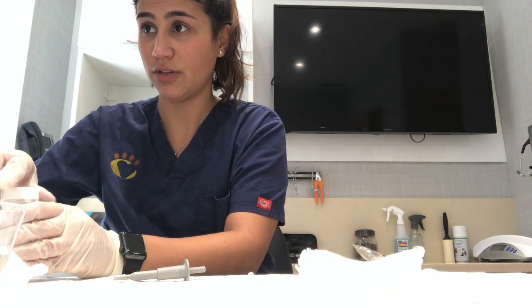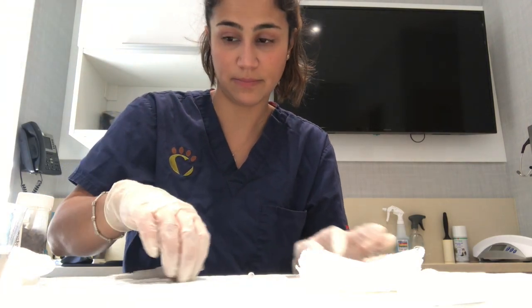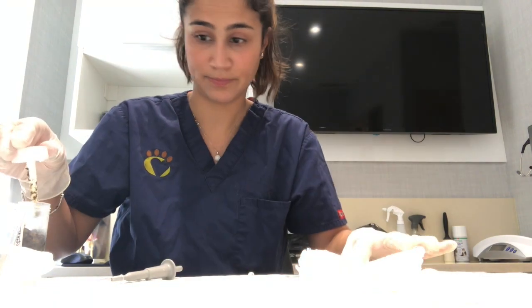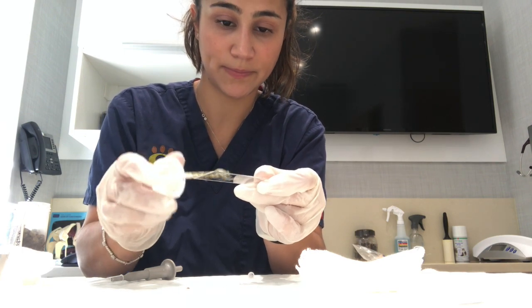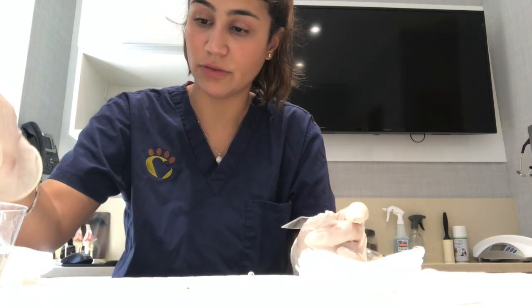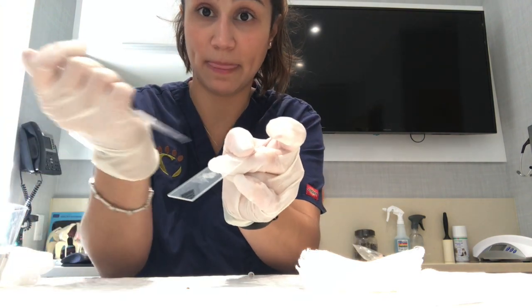So the first thing I'm going to do is take my feces, just a small amount, and place it a little bit on the slide. Not too much, you don't want any big chunks. Good. And then I will be taking a drop of the fecal solution and placing it directly where my stool is.